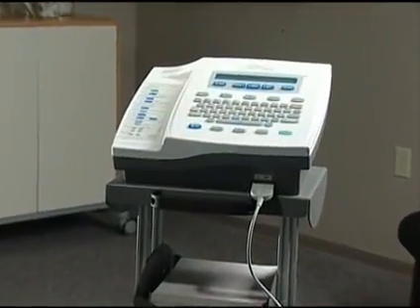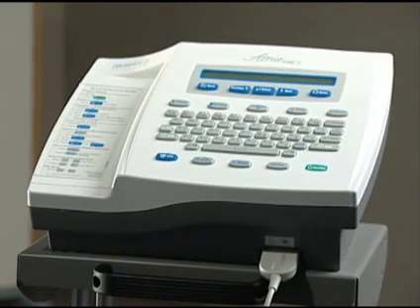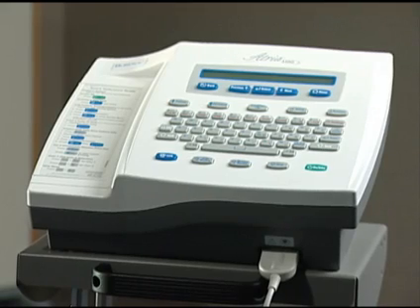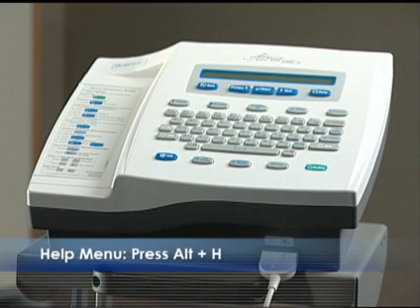Thank you for taking the time to review this Burdick Atria 3100 training session. For further information, refer to the Quick Prep Guide or your Atria 3100 manual. To get a printout of all accessories available for reorder, press the Alt and the H keys, then the Enter key.